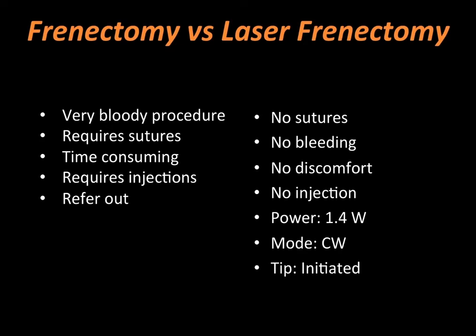With the diode laser, I don't use sutures. There's no bleeding, very little discomfort. As long as you're using the laser correctly and taking your time, we're in great shape. So I don't anesthetize the area. We decrease the power to 1.4 watts in the continuous wave format, and we initiate the tip to cut.